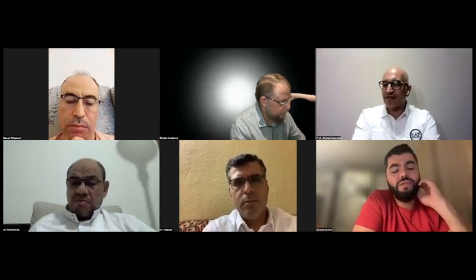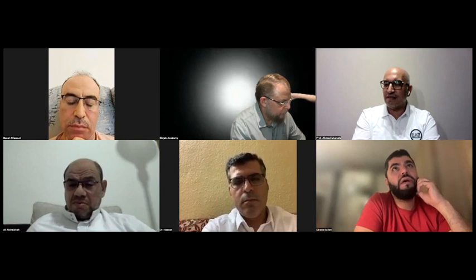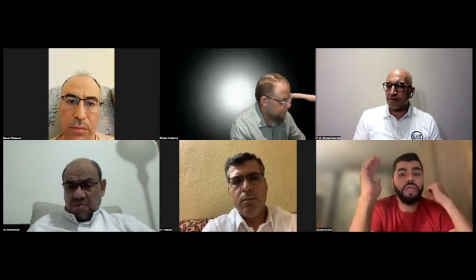Fantastic. Two very pertinent questions. I'll answer your second one first. In my treatment ladder, Sullam al-Ilaj, I tend to leave my tube shunts right towards the end, because I know that a PreserFlo won't work in everyone. I know it works well in 70-year-old white ladies.